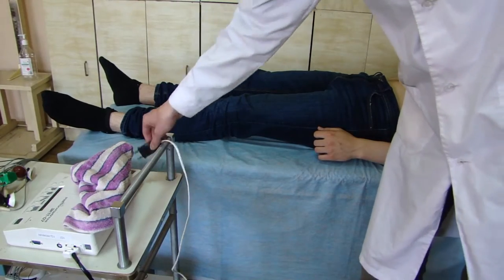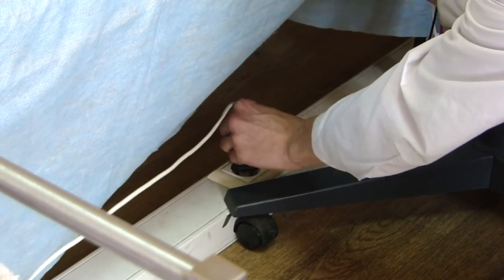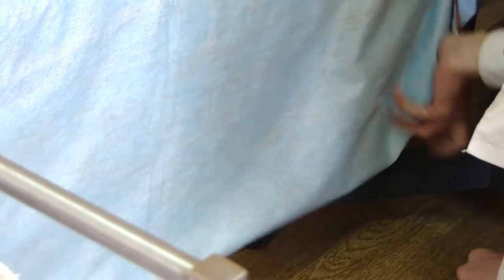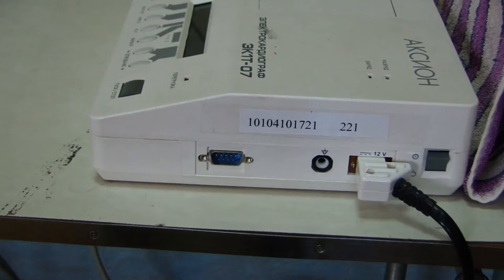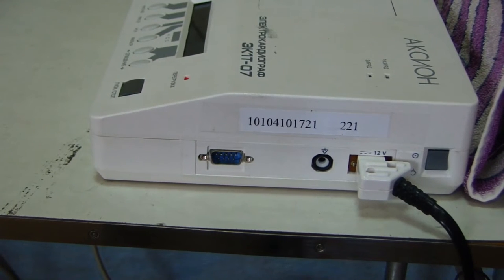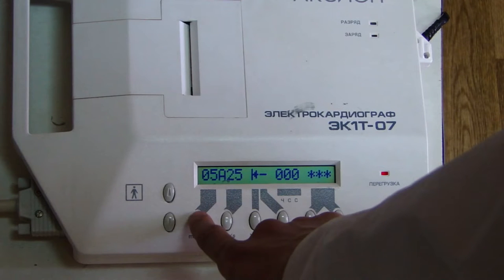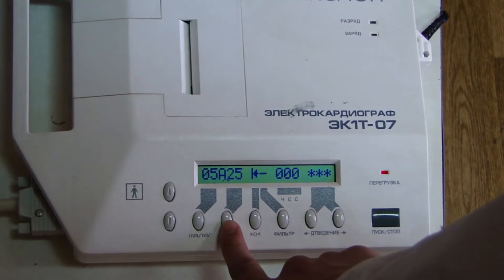After all the electrodes are applied, we start ECG registration. We turn on the cardiograph and connect it to the network. The power button is located on the side surface. To adjust the device, there is a button for the amplitude in millimeters per millivolt, and a button that changes the speed of the tape in millimeters per second.